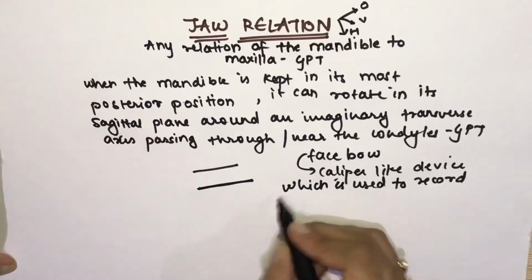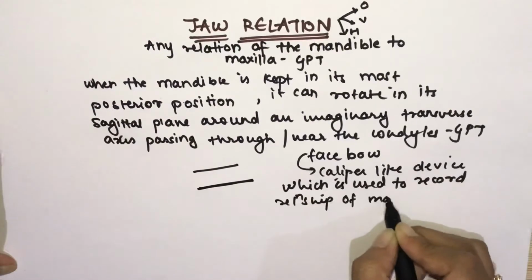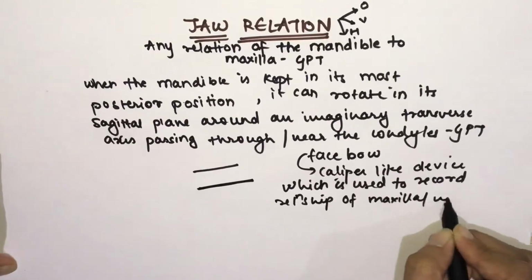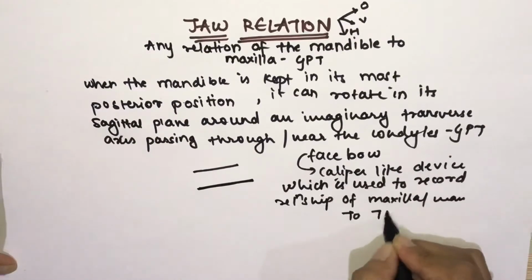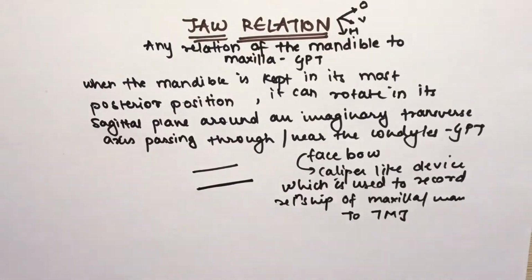So with the help of this instrument, you are recording the relationship of the maxilla and mandible to the temporomandibular joint.